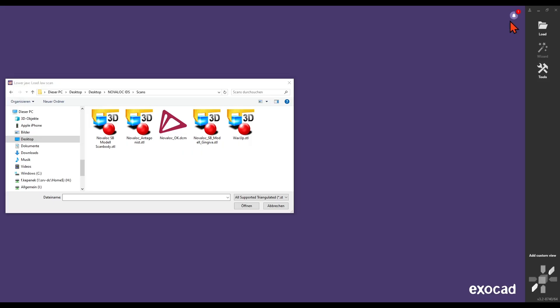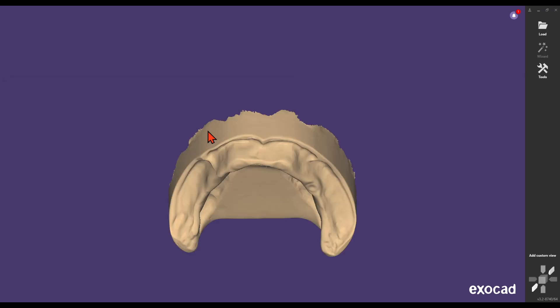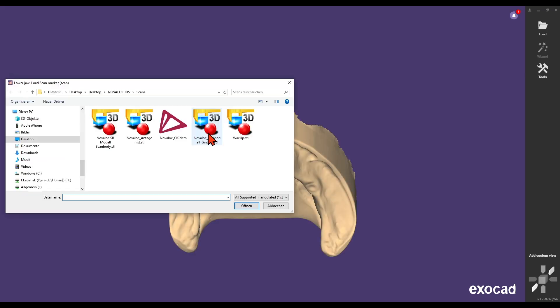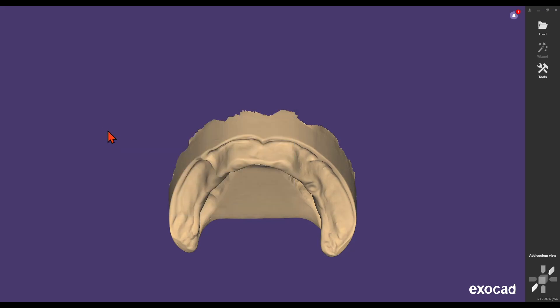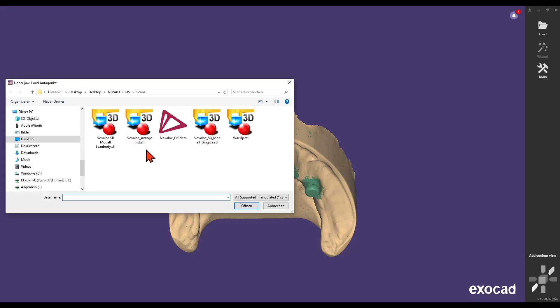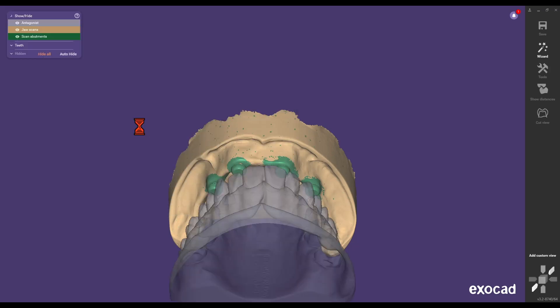First, import the jaw scan, which captures the gingival situation without the scan bodies and abutments. Next, import the scan marker, showing the jaw with visible scan bodies on the abutments. Finally, import the antagonist jaw, representing the opposing jaw.